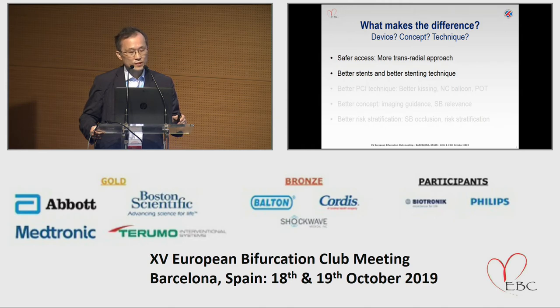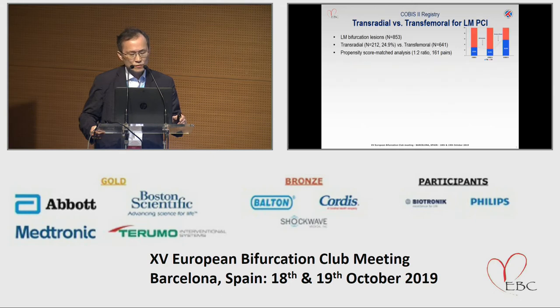So let me start with the access and some stent issues. You've seen this change in trends of the access site from Dr. Do's presentation. In 2014, transradial PCI for bifurcation lesions became more common than transfemoral, and we now know that in 2019, more than 70% of bifurcation PCI is done radially. So what's the difference?